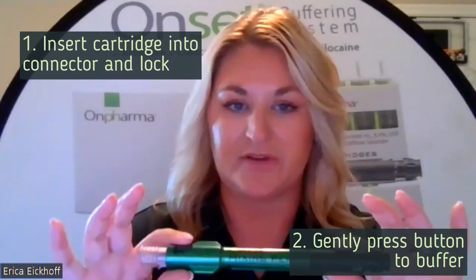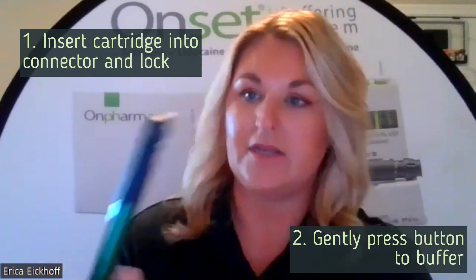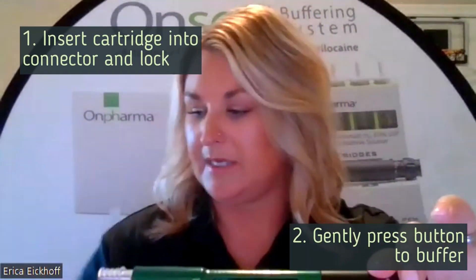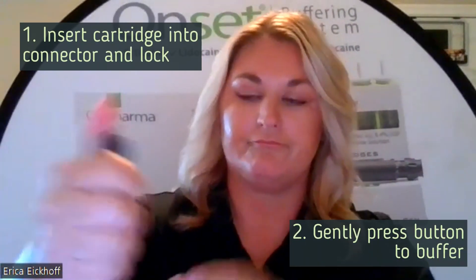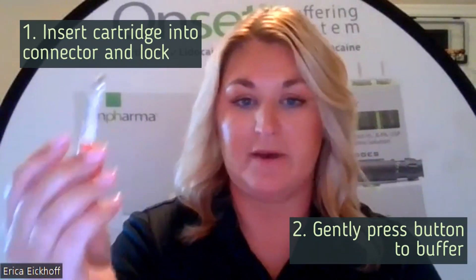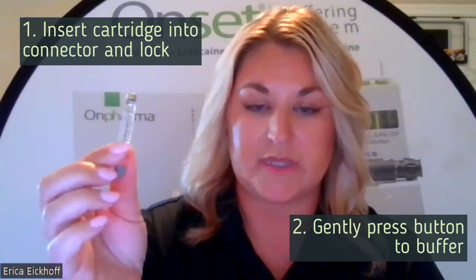Now that we know our products, let's go ahead and set up your pen. But first, I want to show you how easy it really is to buffer your anesthetic chair side. I have a pen here already set up, ready to go. I am going to make sure I am dialed to 9 up top here. Now I have buffered anesthetic. I can load it into the syringe and start the injection within one minute.